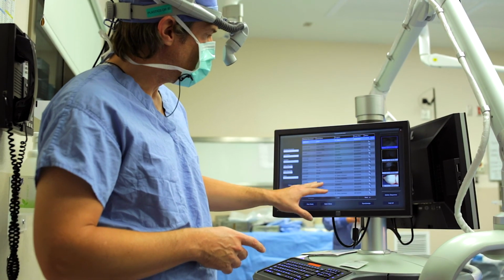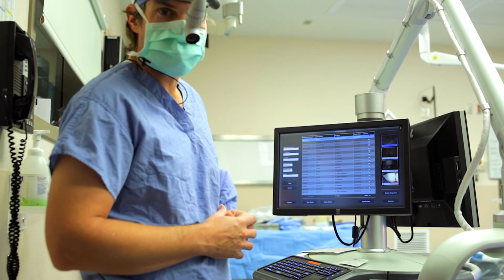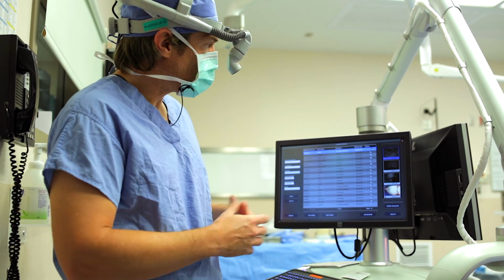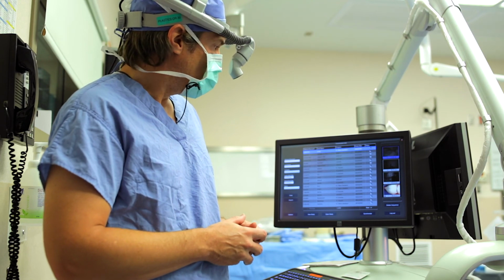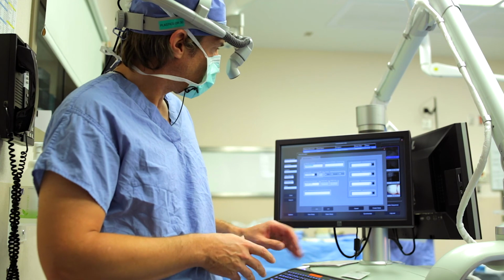You can see this is all information of patients that have had previous SPY studies. And we can review that if we want to go back and look at a patient's sort of historical SPY. But in this case, we're going to do a SPY right now on a patient. And so we are going to open up a new study.